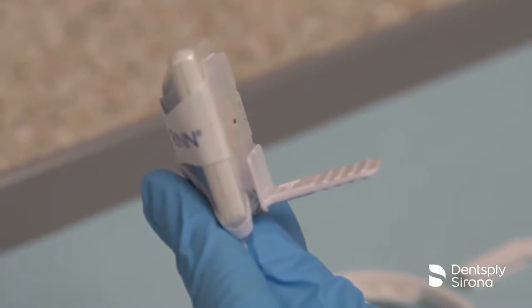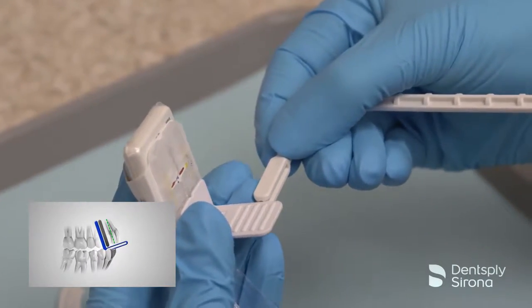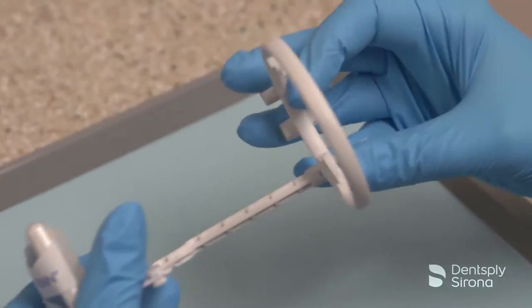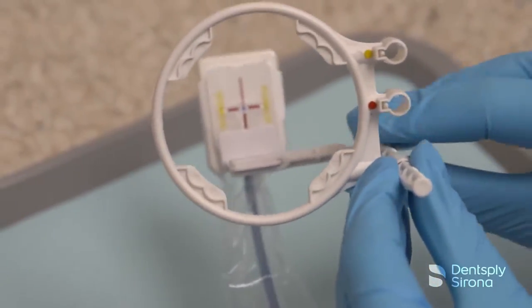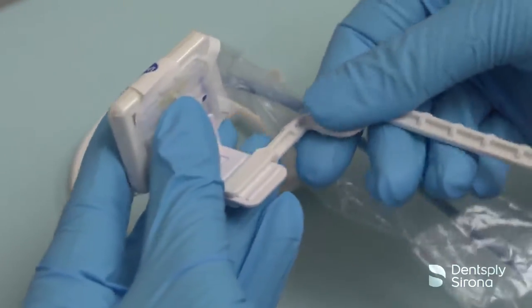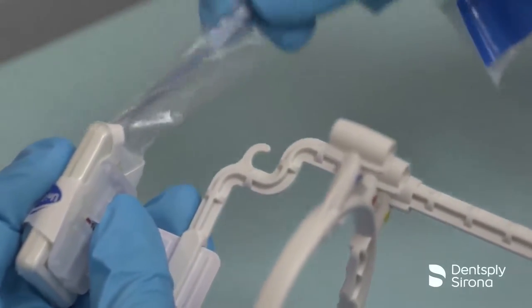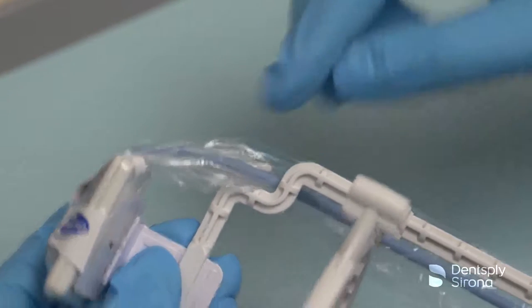To use the UniGrip arm and ring for paralleling technique, simply guide the arm onto the end of the UniGrip 360 bite piece until it snaps into place. Slide the ring onto the arm using the appropriate color to ensure proper adjustment for the type of image being captured. The arm can be adjusted on the bite piece in several locations allowing for comfortable placement depending on the patient's anatomy and presentation. The UniGrip arm and ring system offers a small hook feature to allow the clinician to rest the cord out of the way of the patient's bite and preventing cord drag.